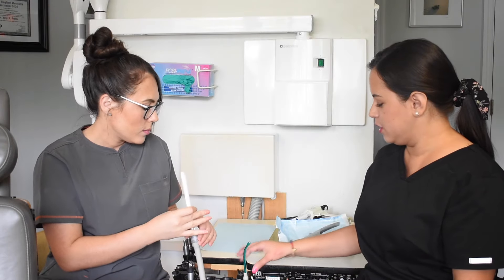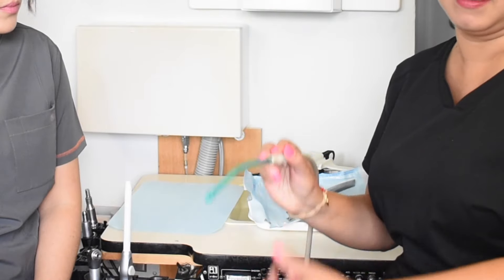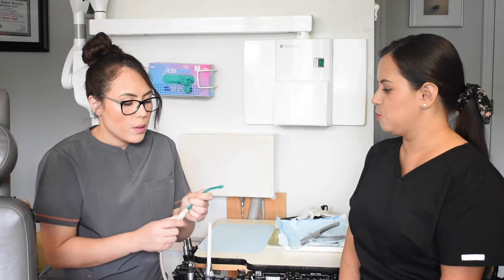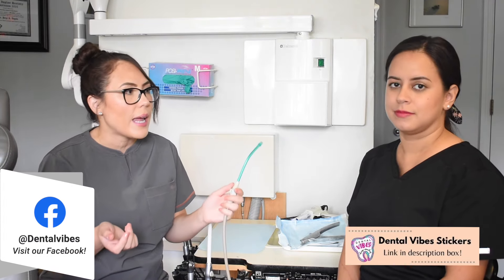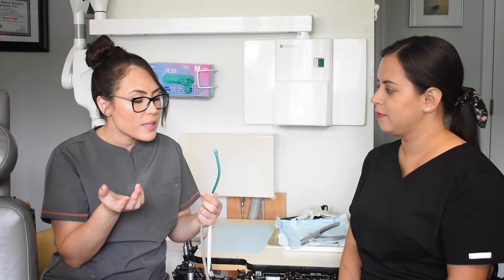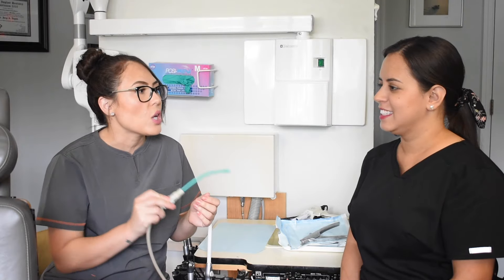For the saliva ejector, it's pretty easy and pretty light. You can hold it like a pen. This lever is pretty easy to use. For most procedures, you're not going to be using it the whole entire time — just in and out whenever you need it and whenever the patient needs to close. One thing you want to remember: the saliva ejector is very flexible, so you don't want to try to retract the tongue or cheek with it — it will just bend.